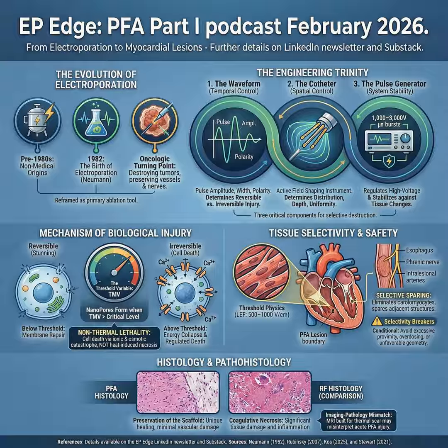Now, tissue selectivity. This is the defining feature of PFA, but it's often oversimplified. PFA doesn't choose myocardium, it creates an electric field distribution. Injury occurs where the field exceeds the lethal threshold for that tissue under that waveform and pulse train. Thresholds differ by tissue type, and effective thresholds vary with waveform. In many electroporation frameworks used for cardiac applications, lethal thresholds are discussed roughly in the several hundred to around 1,000 volts per centimeter range, and myocardium often shows comparatively lower susceptibility thresholds than some adjacent structures.